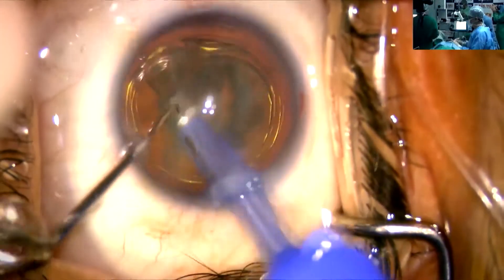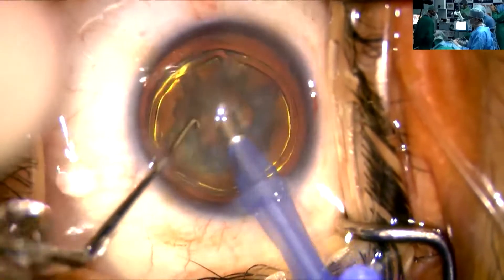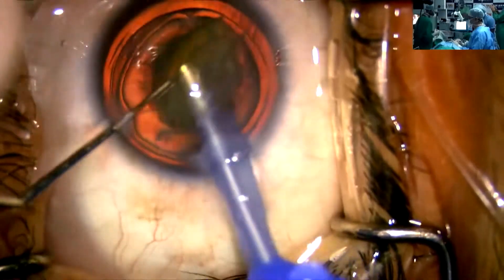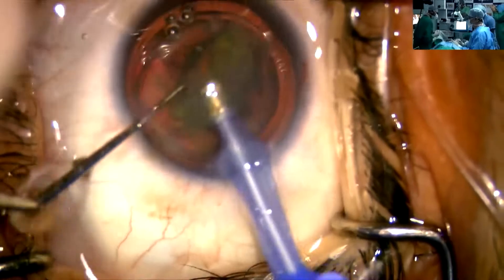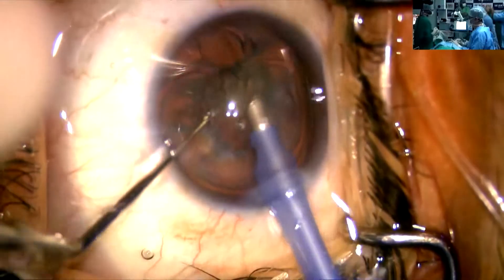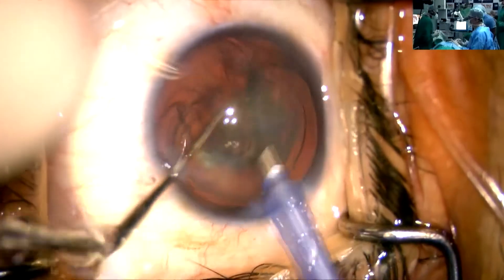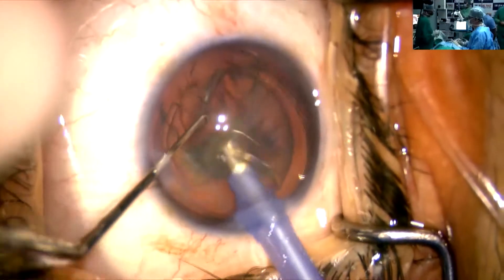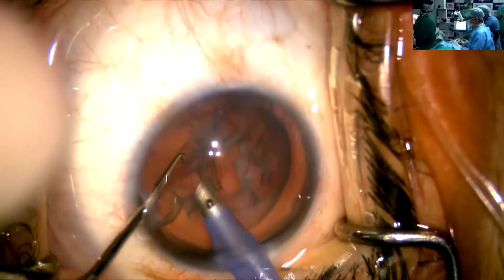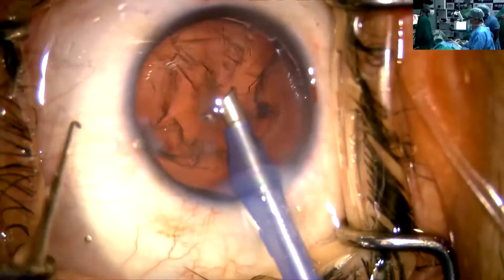No need to rotate much. I am in the center, carefully just removing the nucleus, which is just as soft as an epinucleus. So far, so good stability. Now I am going under the epinucleus mode. Suction is at 310 and still you can see the stability. Just remain in the center and phaco is done. Although this was a soft cataract, now I will be doing the irrigation aspiration.